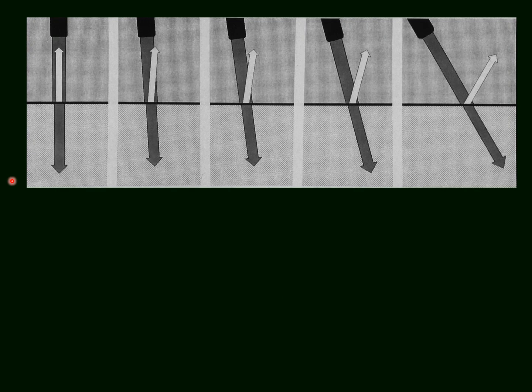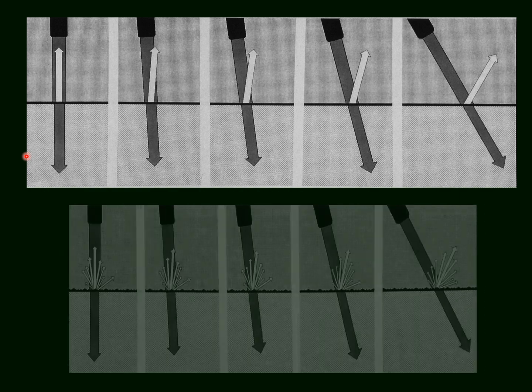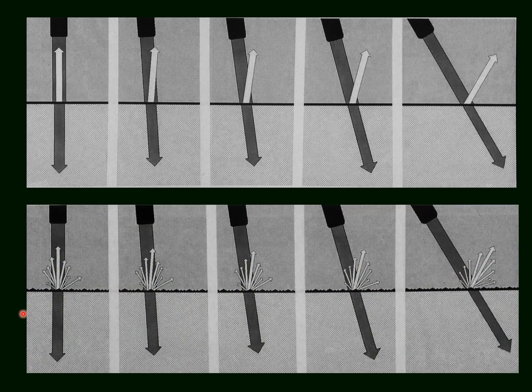When we look again at different angles of incidence, at a smooth interface, very quickly the echo signal is weakened or disappears entirely. In a coarse interface, the echo signals weaken, but we see, even with oblique sound beam incidence, still echoes from that surface.